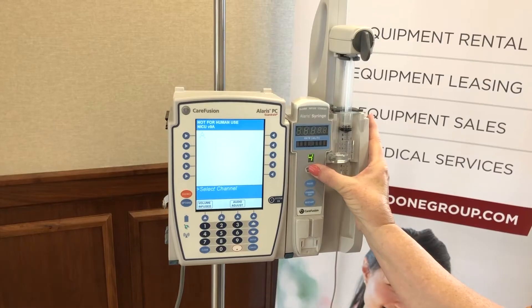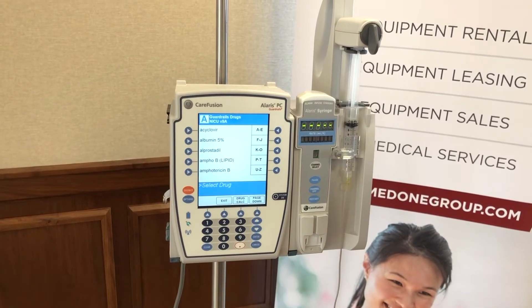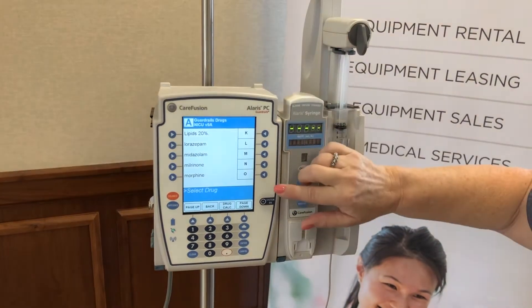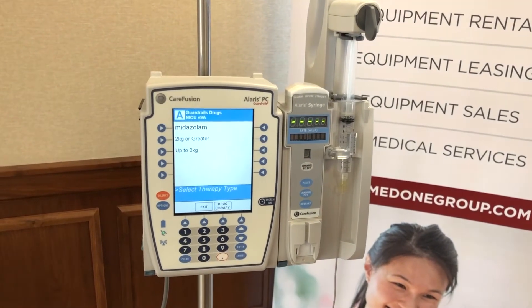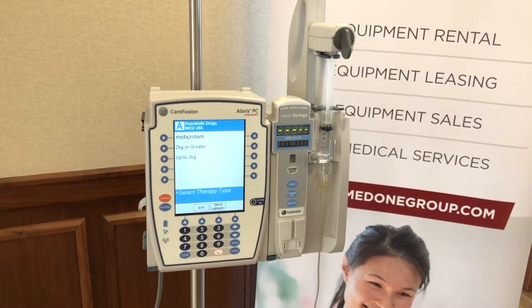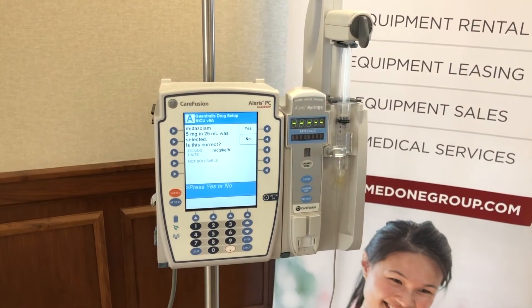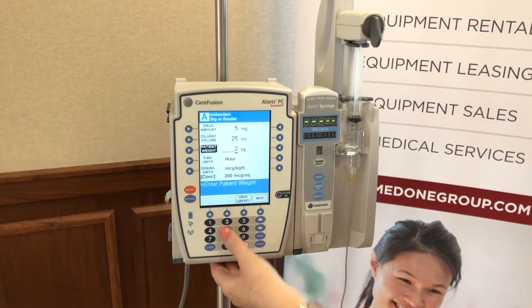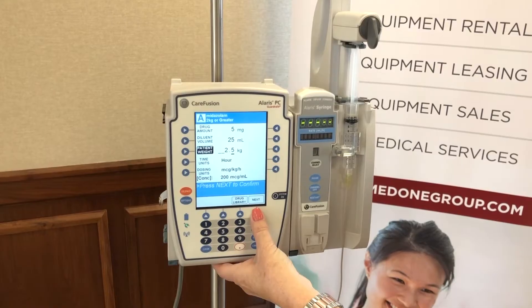We press channel select again and choose the top entry: Guardrails drugs. We're going to do midazolam, so she presses K through O, then M — the drug is listed so she presses midazolam on the left. Based on your hospital's pharmacy guidelines, various drugs and parameters will be available. For this scenario we'll use two kilos or greater, choose the five milligrams in 25 mls, confirm that's what we want, then enter the patient's weight — our baby weighs 2.5 kg. The system will remember this weight for every other weight-based drug, each and every time.